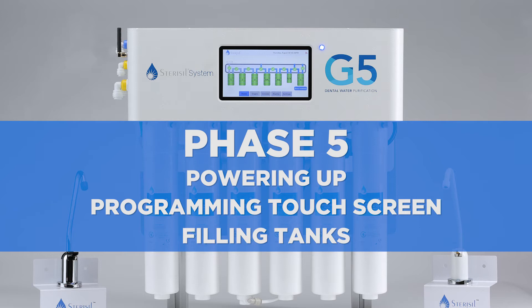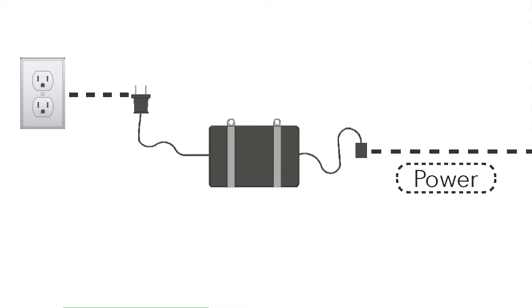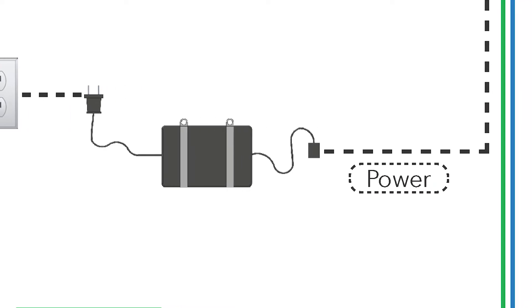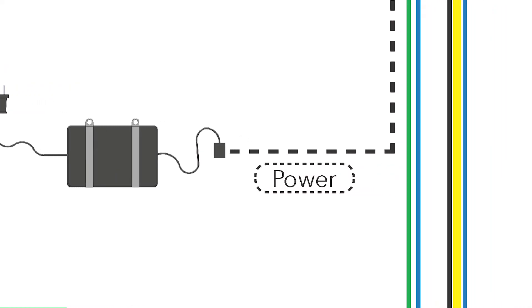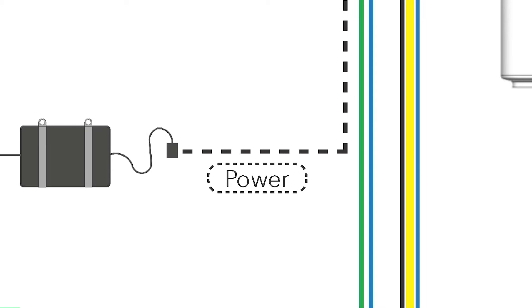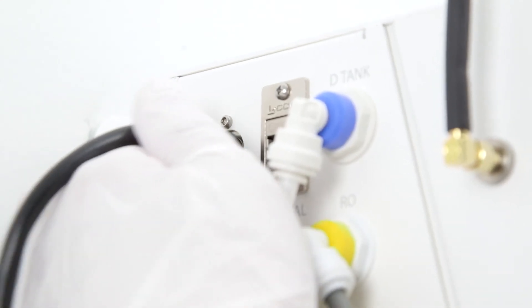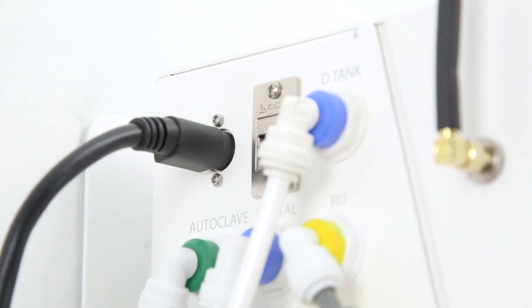Phase 5. Powering up, programming the touchscreen, and filling. Powering up the system. Power adapter. Select a location within 6 feet of the outlet and ensure the power cord can reach both the outlet and the system without tension on the cable. When you plug the unit in, the touchscreen will power on and you'll be brought to the home screen.